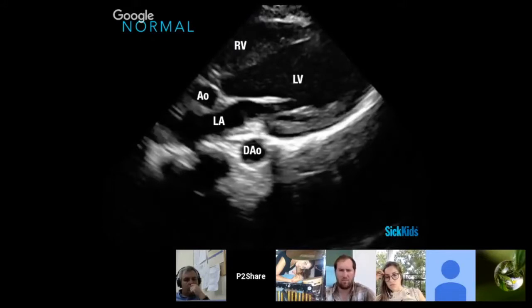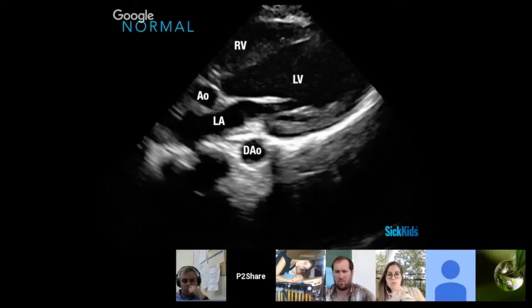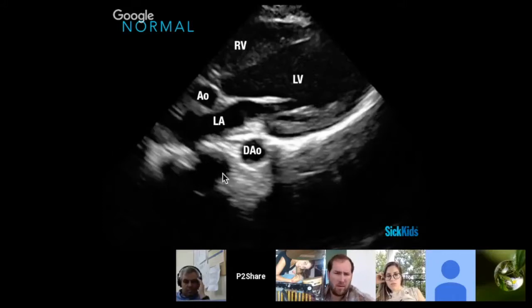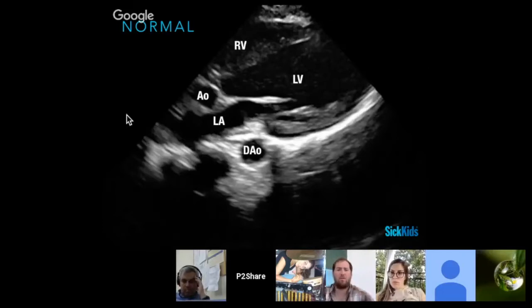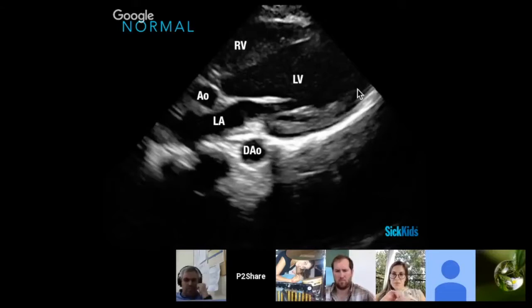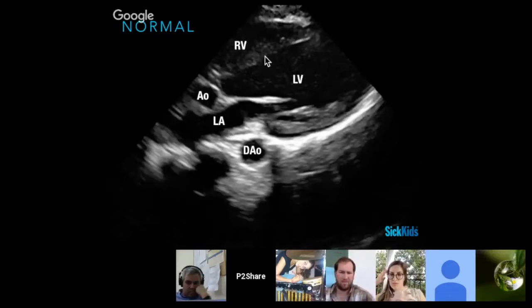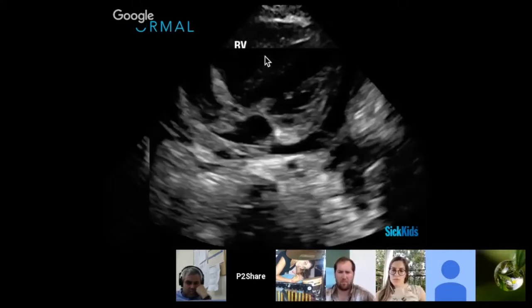In this normal view, the most important thing is the valve. We want to see the inflow tract from the left atrium to the left ventricle, the outflow tract through the aortic valve, and most importantly we want to see the squeeze in the left ventricle and the valve slapping nicely. You've got your right ventricle on top, your left ventricle, your left atrium, and your aortic outflow tract. Important to point out is the descending aorta at the bottom of the image — that's going to be important for a few reasons.